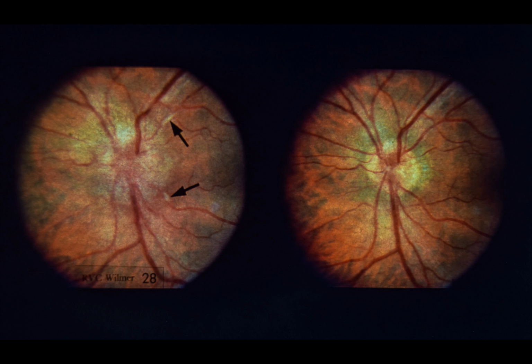Slit lamp examination revealed mild iritis, keratic precipitates, and clear vitreous in both eyes. General physical examination showed a maculopapular eruption on both palms, and serologic test for syphilis was positive in both serum and spinal fluid. Left. The left optic disc is edematous and hyperemic, with dilatation of superficial disc vessels as well as retinal veins. Arrows point to perivascular exudates along small superior and inferior temporal vessels.